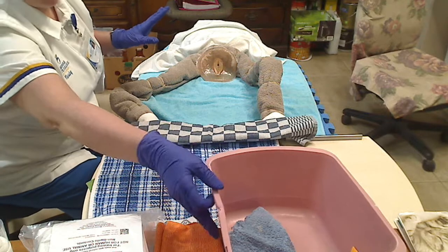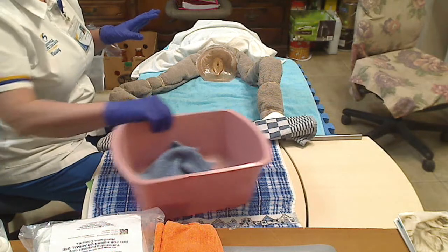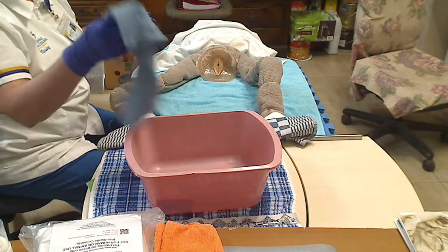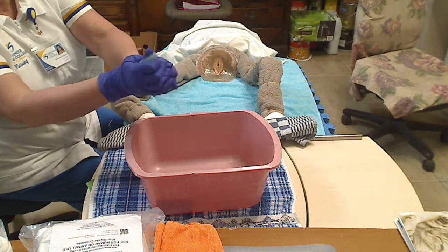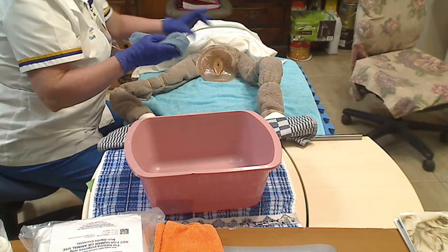So from here, I'm going to go ahead and put the bucket down between her legs. When I wash, oops, blocking the view. When I wash, I'm going to make sure not to use the same section of the rag on any part of her body. So I'm going to pull it up. I'm going to wring it out. And then I'm going to talk to her. Anna, I'm going to go ahead and touch you and clean you now. Is that all right? Yes.